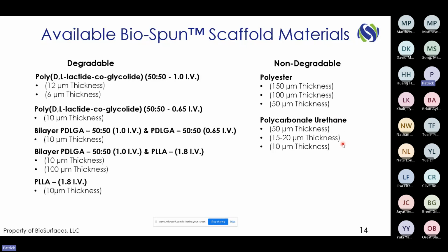And then finally, we have the polycarbonate urethane membrane. This scaffold has some nice properties in that it's not degradable, but it also has some flexibility and elasticity to it. So for example, we're evaluating it for use on kind of like a breathable, I showed you in the prior slide, the alveolus chip, where it can flex and breathe. So this is a urethane kind of membrane. We think they're going to have utility in situations like that. In fact, we're actually working on that one as well.